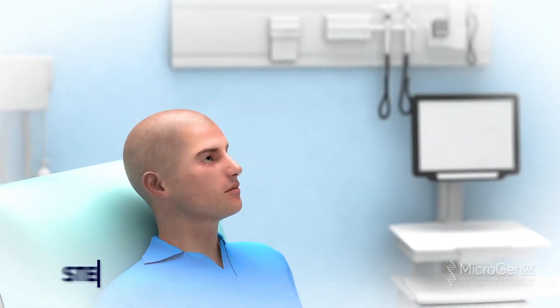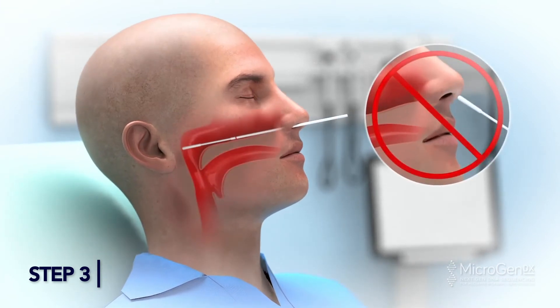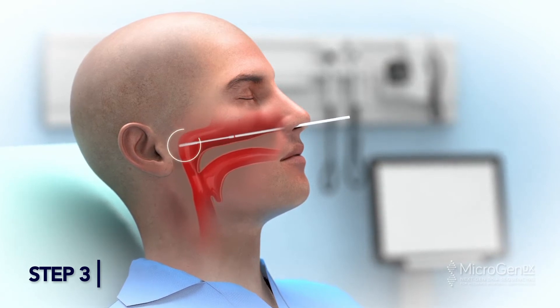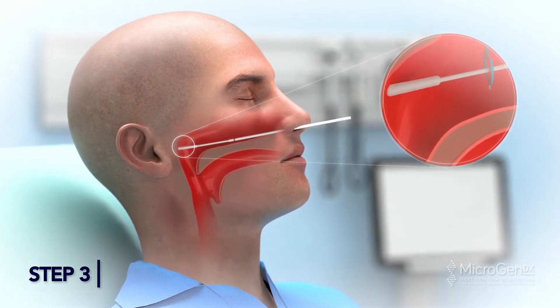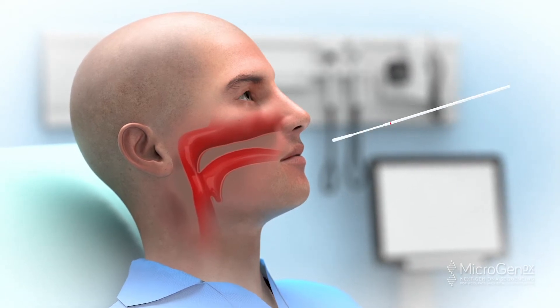Step 3. Insert the dry swab through one nostril straight back, not upward, along the floor of the nasal passage until you reach the posterior wall of the nasal pharynx. Rotate the swab gently, then leave in place a few seconds. Carefully remove the swab without touching the sides of the nostril.